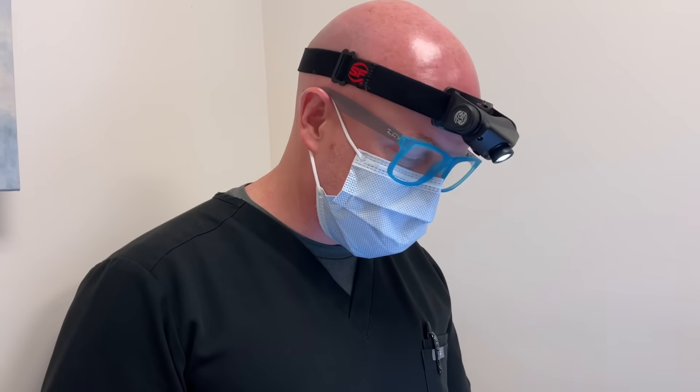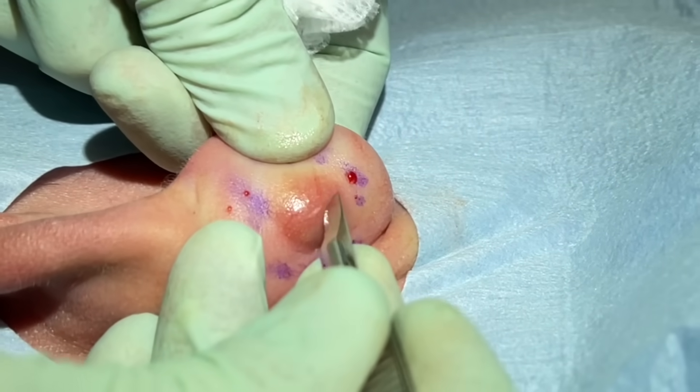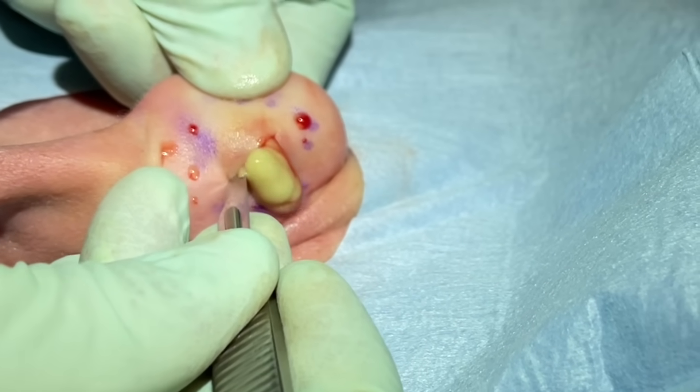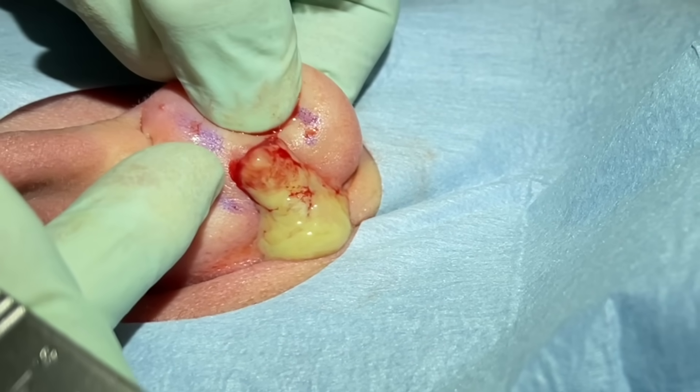Mr. Popsit here. We've got the earlobe abscess which is a small cyst that I'm hoping we're going to be able to get out. It kind of got inflamed — he was scheduled for surgery and just in the last couple days it got inflamed, so we're going to see what we get out of this. Just make a small cut and try to drain this pocket. We should get some cyst contents and some fluid here. Just a little cut on the back of the ear. There we go — that's exactly what I thought we were going to get pretty quickly.